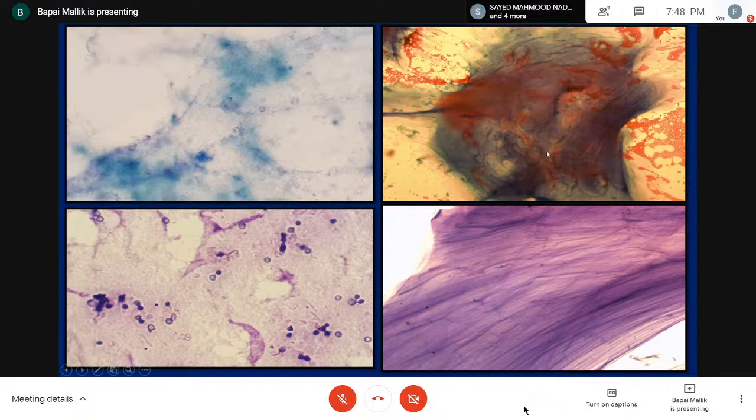But at this point I would like to say something: in many situations, a mucinous neoplasm may not show this thick mucin. Almost 50% of mucinous neoplasms may actually show a very thin kind of mucin, when things become very difficult. Under those circumstances, we have to rely on other modalities, which we are going to discuss a little bit later on.